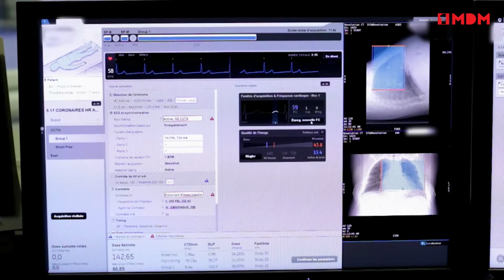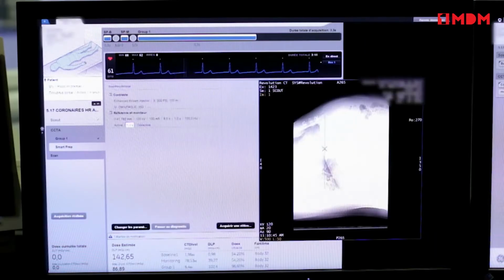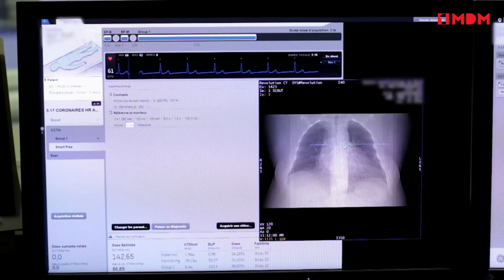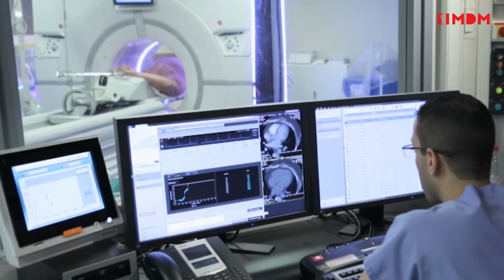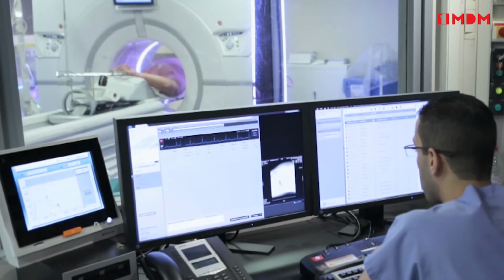Using the SCOUT and the data from this test, Revolution CT's auto-gating technology helps you get the right settings for kilovolts, milliamps, and acquisition phase to help meet your image quality goals while lowering dose. The automatic bolus tracking system helps you synchronize the acquisition with the injection. Once the predefined threshold is reached, the acquisition is triggered and the entire examination is performed in only one beat.